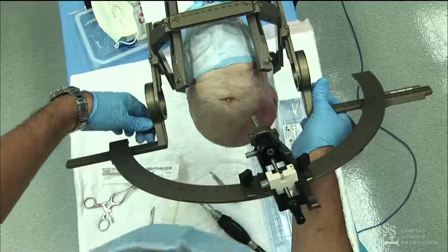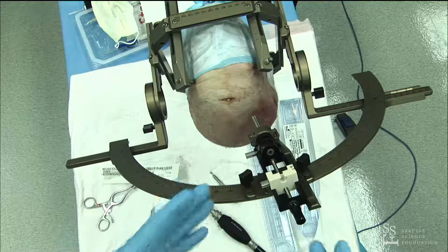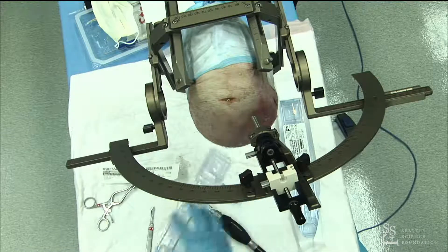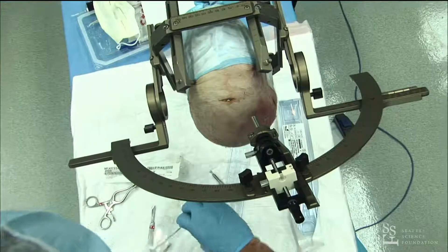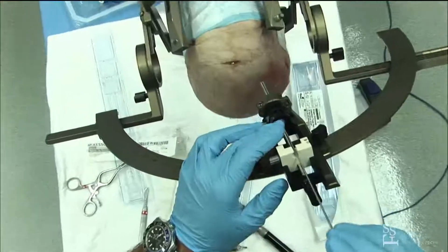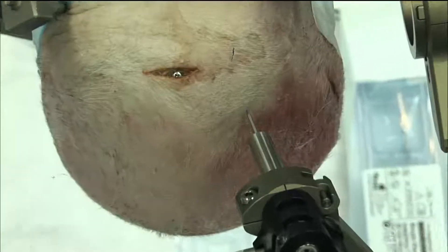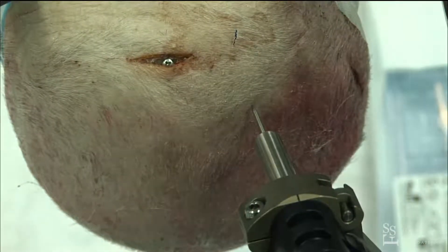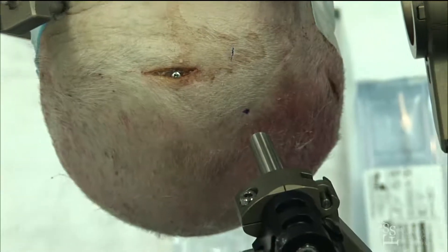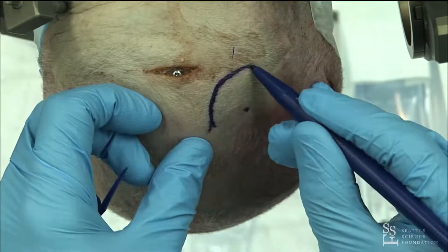So once you have that, assuming accuracy of fusion and everything, I will often almost go in blind because I know that with the ring, arc, and XYZ, we should be sitting right on our gyrus, avoiding a blood vessel. I use contrast MRI to make sure of that. This is a sharp tip stylet that I use — it's nice for puncturing dura. I'll actually use monopolar on this right on dura and keep it there for about 15 seconds to really let all that dura melt away. But we'll use this to plan our entry point.